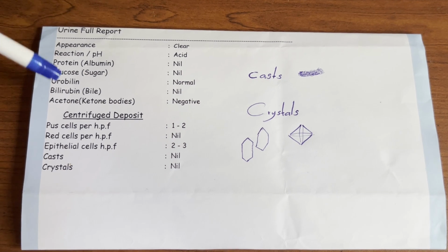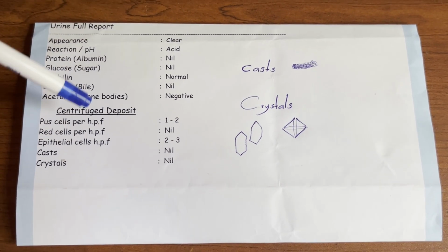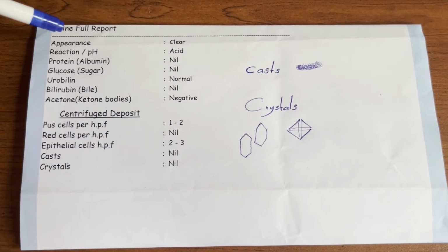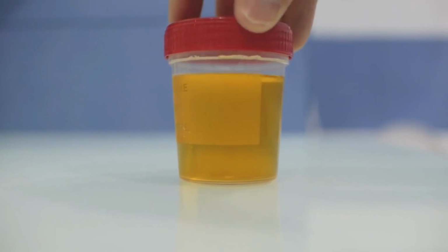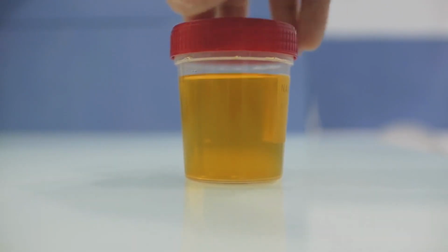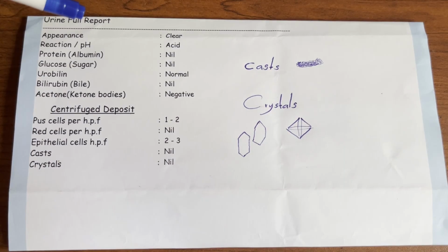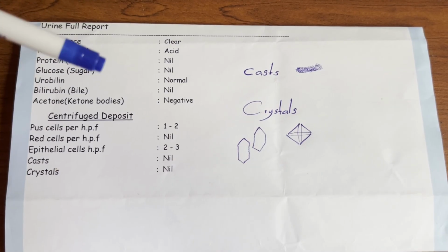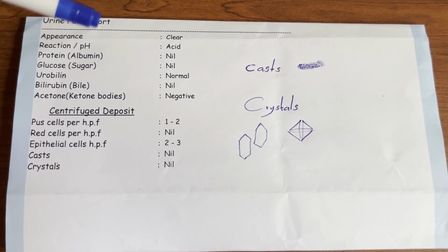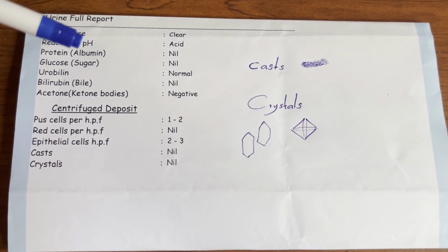Looking back across this entire document, every single physical, chemical, and microscopic marker sits well within the healthy physiological baseline. When you go for a urine test, always ensure you collect a clean catch midstream sample first thing in the morning to prevent false positives from skin flora or diluted readings. Remember, laboratory reports are diagnostic tools meant to be interpreted alongside your clinical history, symptoms, and physical examinations by a qualified healthcare provider.